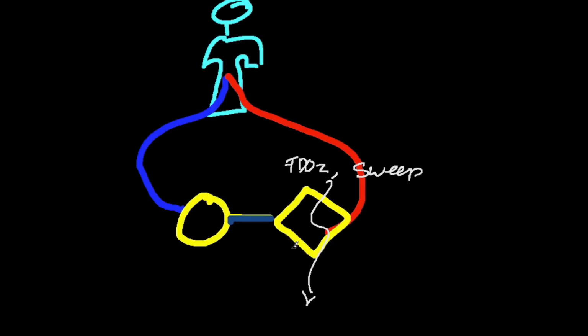Okay, so given all this control that you have over the system, how do you analyze it once it's set up? Well, most important thing is don't ignore the patient. So whatever the patient's telling you is right. And so you're going to be looking for indices of perfusion of the patient. Things like lactate, things like pH, things like warmth, organ dysfunction, etc. Secondly, you're going to be looking at oxygen saturation. You want to make sure that what you're delivering to the body is getting there. And so you're going to get an ABG from the right arm somewhere.